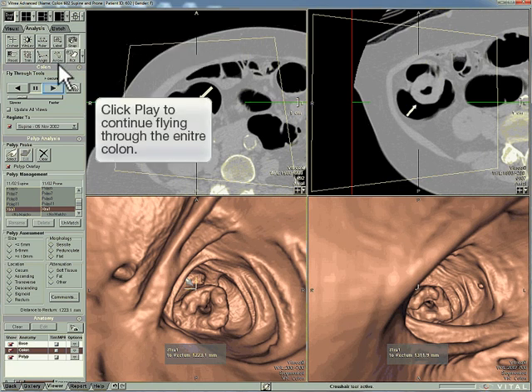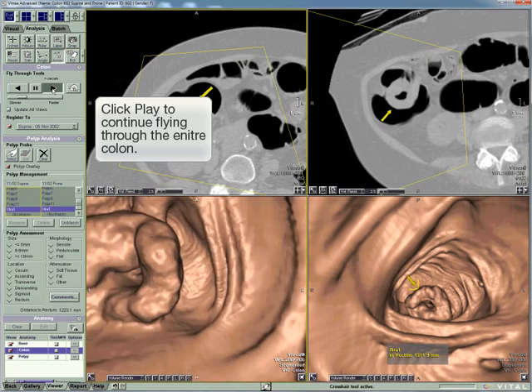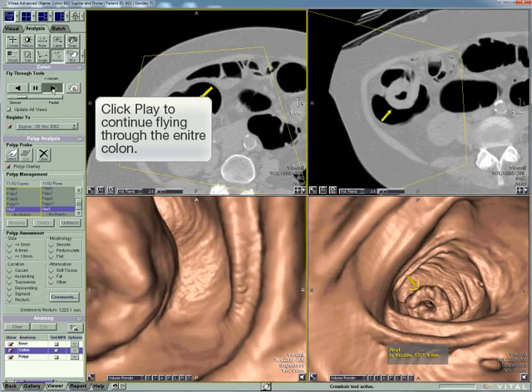Click the play button to continue flying through the entire colon. Click the arrow, click the check button, then click and drag to zoom.